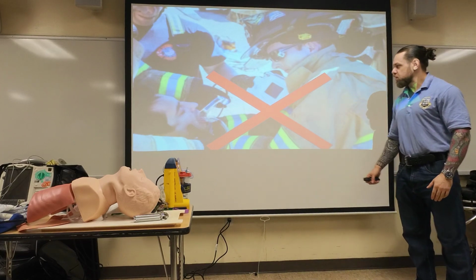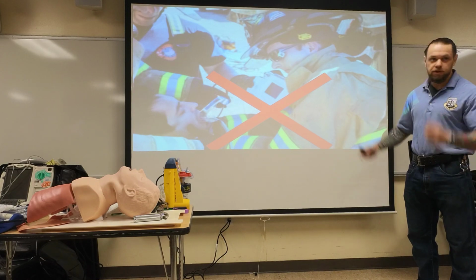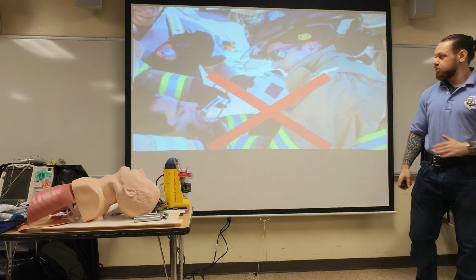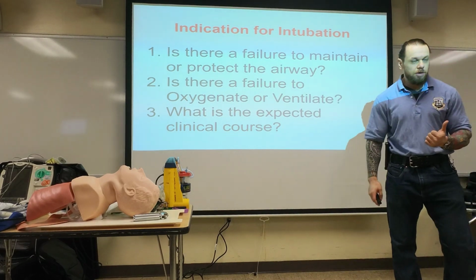If you see these types of pictures where this guy is performing the procedure, he has no PPE on, no face protection. He has the sunglasses, it looks cool. You're going to be doing none of that, right? So none of this. And so we're going to talk about the indications of intubation.